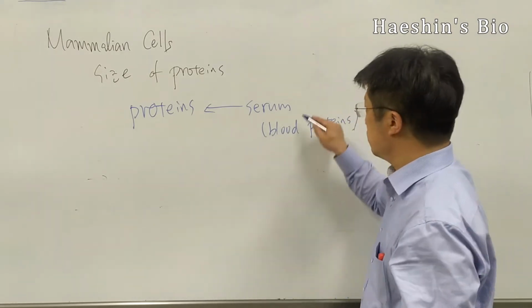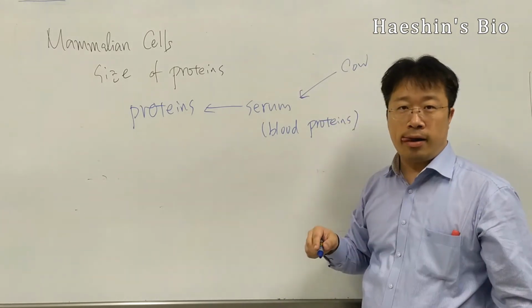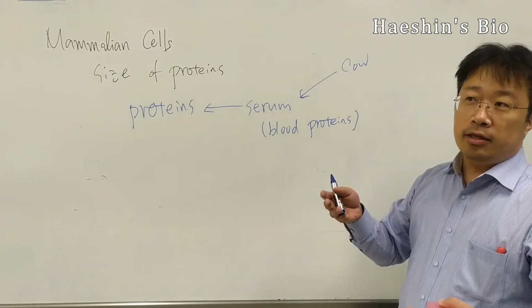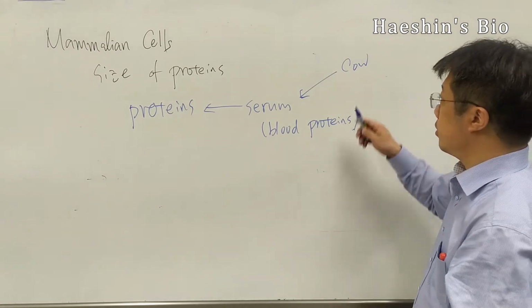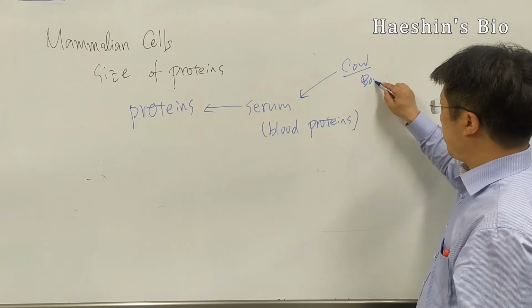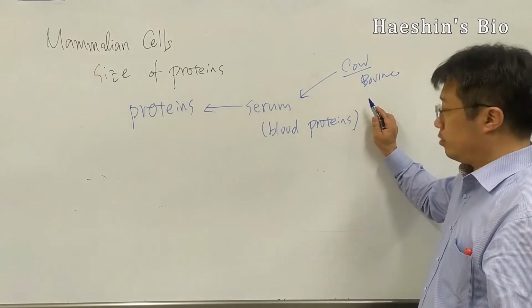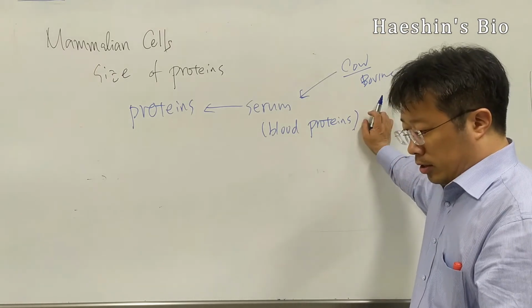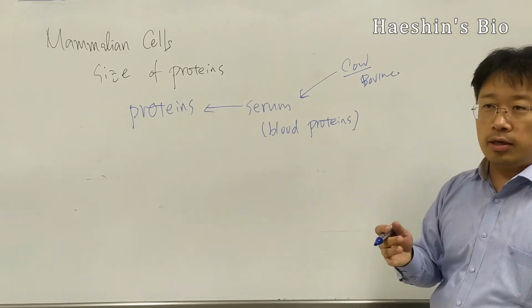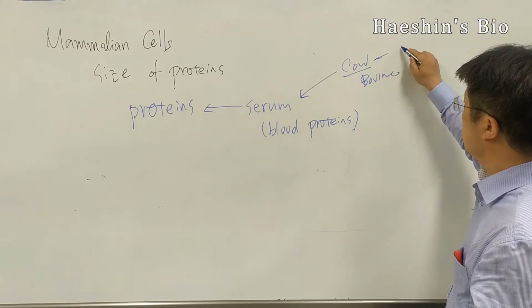So where does the blood come from? Because we eat cow, beef, we have a lot of blood. So we get a bovine source, and especially the source is actually when they have a pregnancy, then they have a baby cow, the fetal.